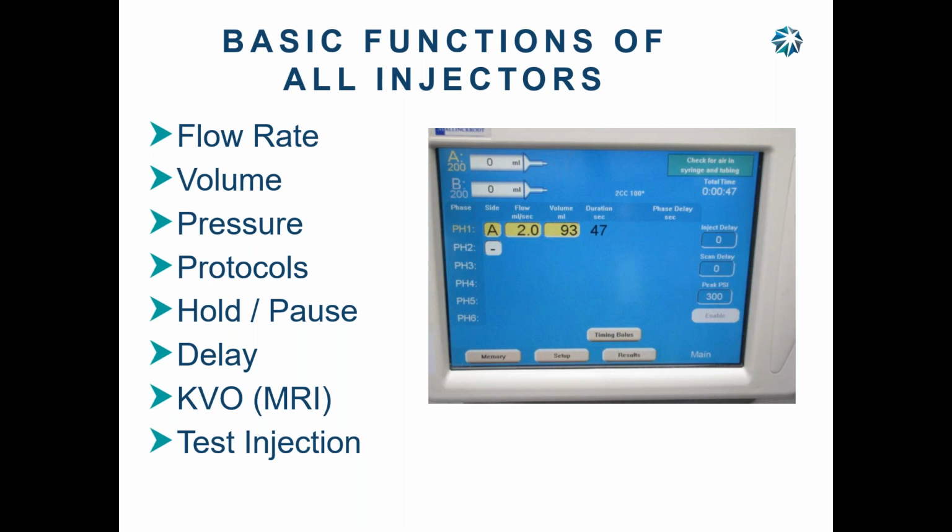So you start the injection, and at 5 seconds, it will send a signal over to the CT or to the cath lab, or the MR doesn't do it, and it'll start the scan. It'll start the CT up, or it'll start the imaging on the cath lab. So these will talk to the modalities. It's just a simple signal it sends over there, except for Siemens, that sends a signal saying start the X-ray, and then the X-ray starts. And that's where the delay comes in.